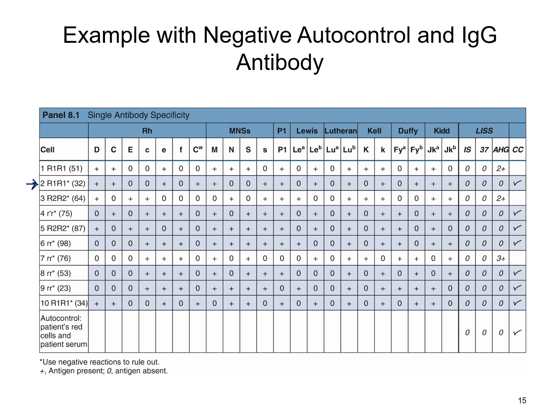And when we're doing our rule-outs and we're going across, I want you to keep in mind that when you see these pluses, that just means that that particular antigen is present on that particular donor cell there. So for example, when we're looking at our cell number 2 here, we know that this particular donor has the D antigen.